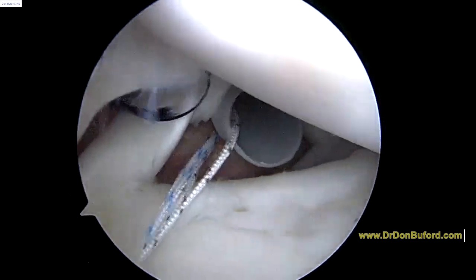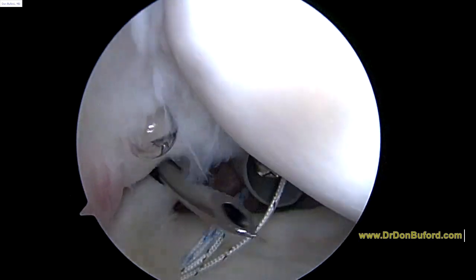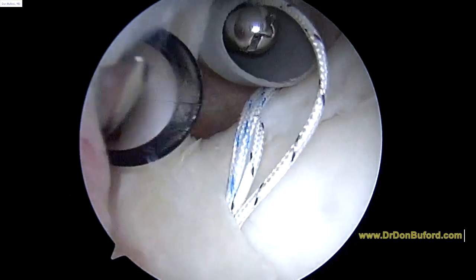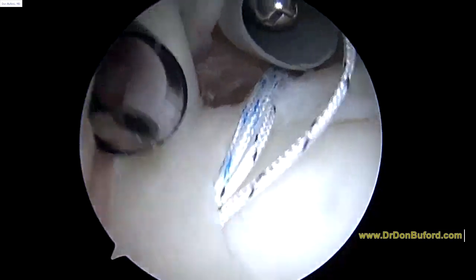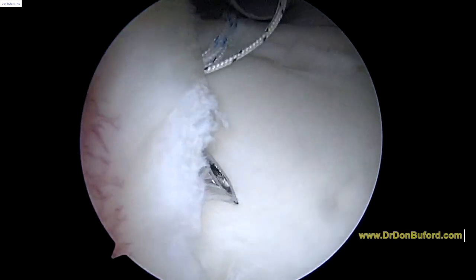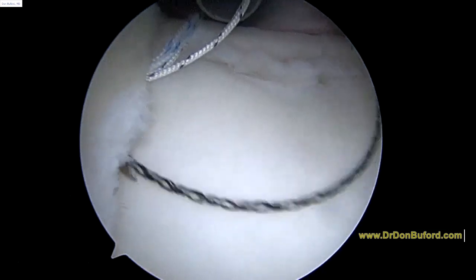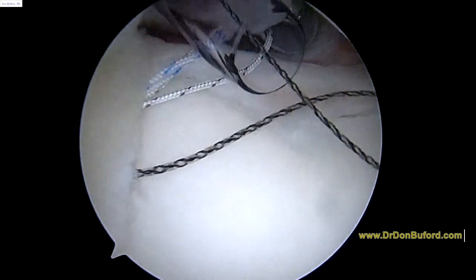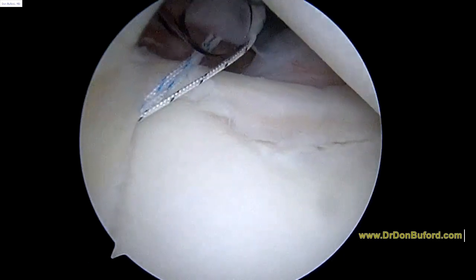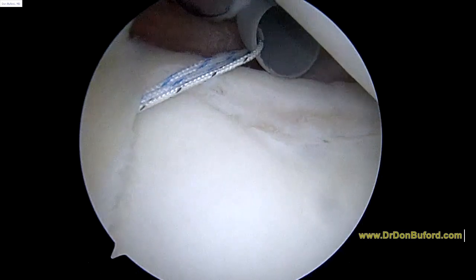Now the next step is to take a grasper and use, hold the camera, I gotta pull this all the way back. We're gonna use this suture hook. See how that comes out underneath the labrum behind the biceps. Hold that real steady right there. We'll feed the relay through. And we'll back it out. We're going to retrieve the relay here. And then outside your shoulder, we're going to load that with a suture.